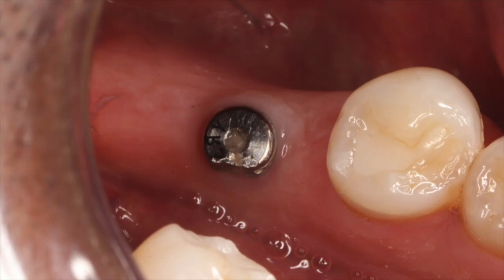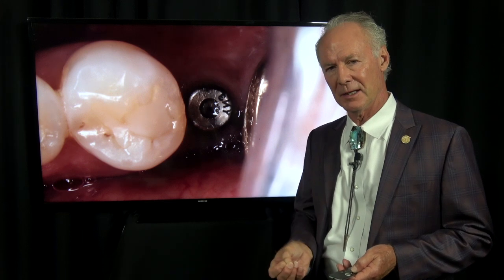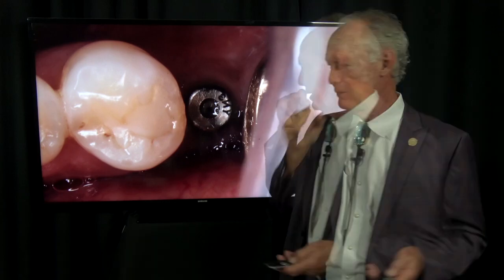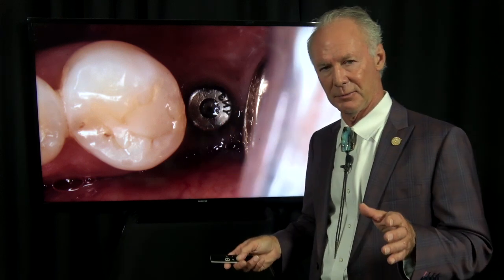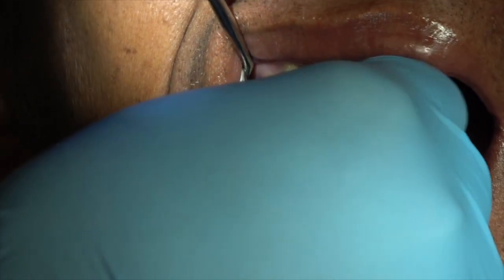These healing abutments have been in place for three months since I placed the implants. Some people place abutments on implants at the time of placement — I never do that. I've seen many implants loosen because somebody placed a provisional restoration on the implant at seating and the patient bit down on it. It's like a metal fence post in concrete — if you wiggle it before the concrete sets, you lose the fence post. I want the implant to have three months to osseointegrate before any pressure is placed on it.